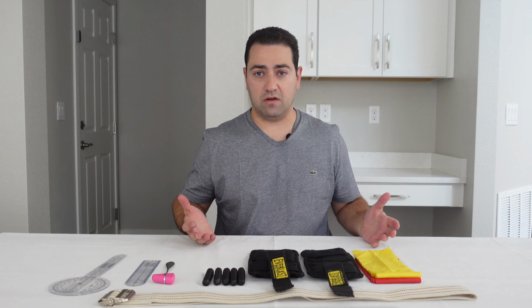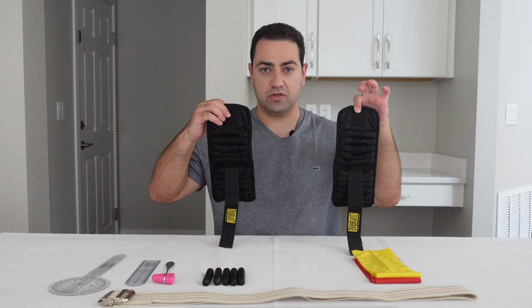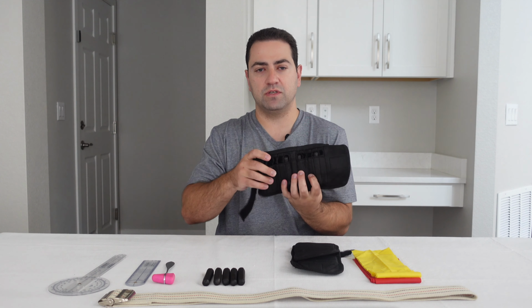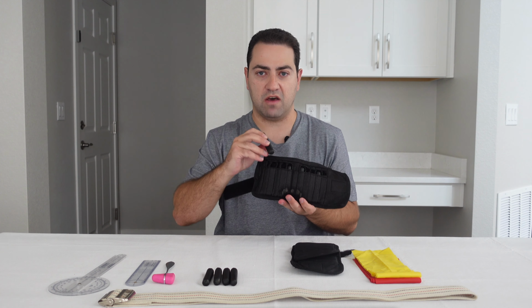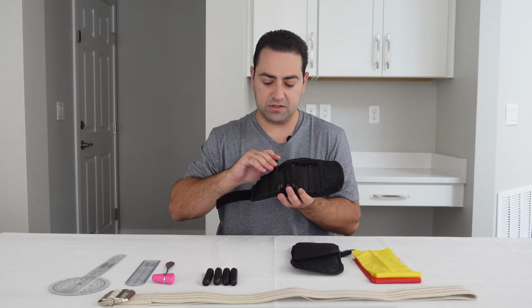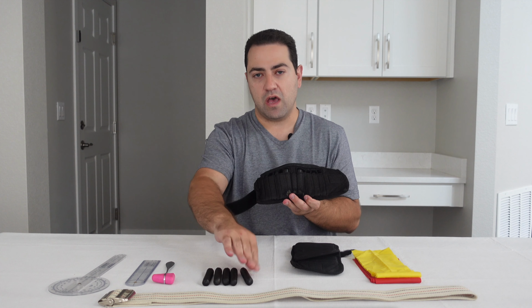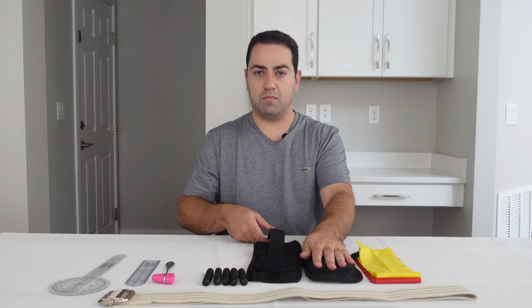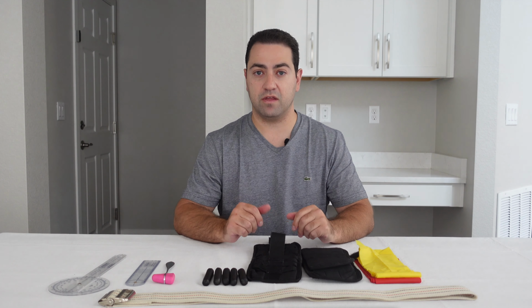I always have a set of universal wrist or ankle weights in my bag. When I say universal, I really mean it. These weights can easily be adjusted from 0 to 5 pounds. Each of these metal inserts weighs approximately half a pound and can be adjusted in a matter of seconds by inserting or removing these metal weights. Everlast makes these. I actually found them in a thrift store for a couple dollars. Probably one of the best thrift store purchases for home health that I've made.